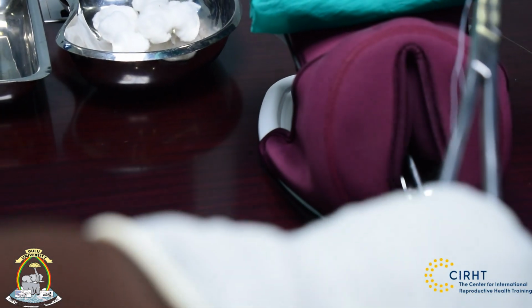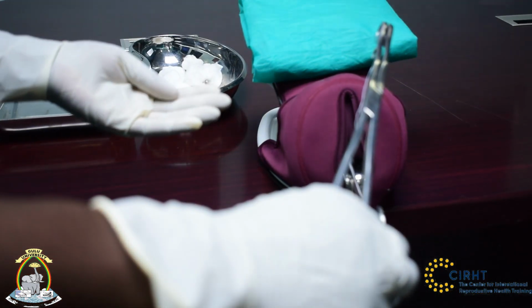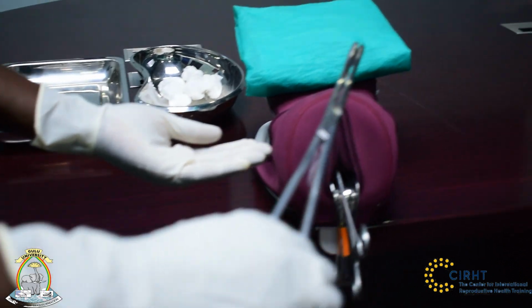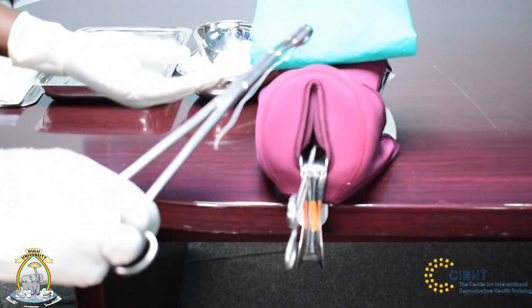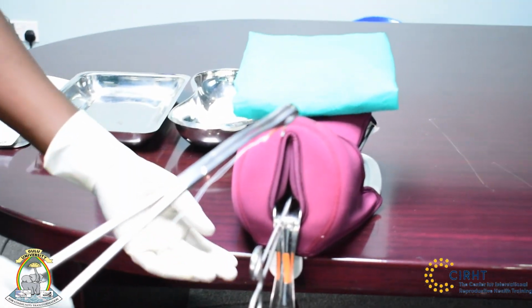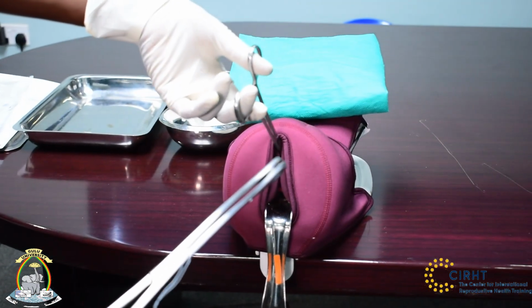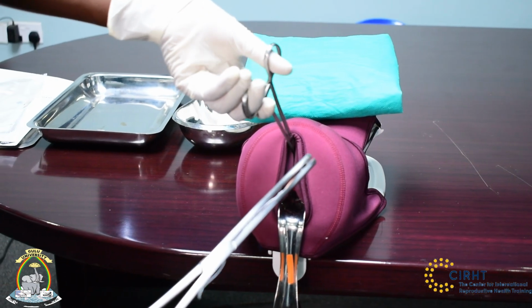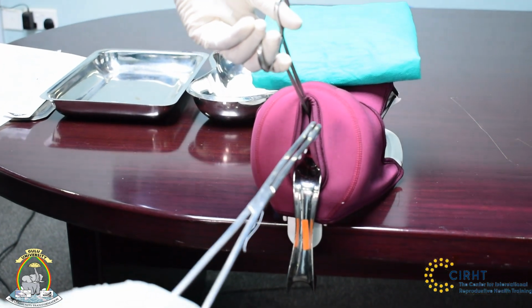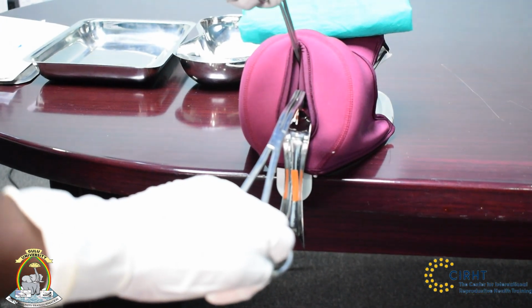So remember, we said this is a non-touch technique. So the IUD should not touch the surrounding of the mother, should not touch the Sims speculum. Also, we should ensure that it's not touching the walls of the vagina as you're inserting it. So we are going to hold our ring forceps or our sponge holding forceps, which is clamping the anterior lip of the cervix. So gently, we are going to insert the IUD, making sure it's not touching anything.